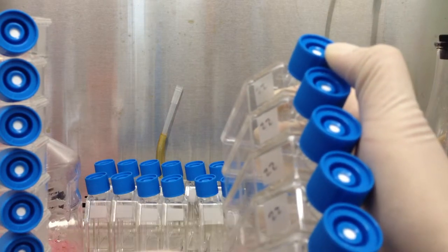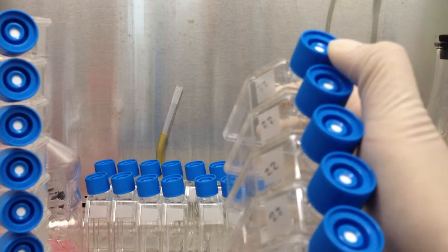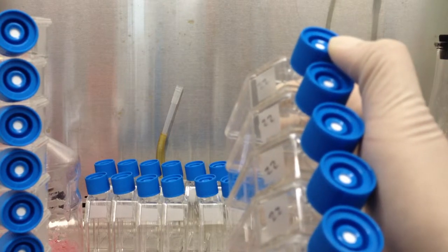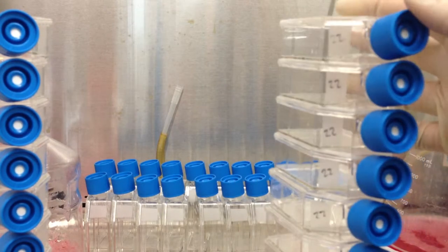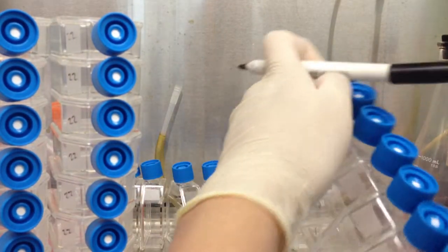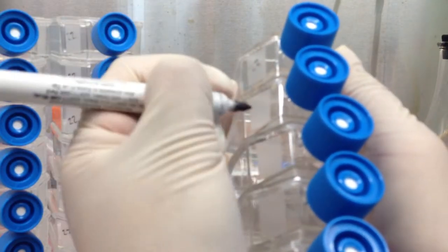And I pretty much, for organization, write the passage number on the side of the flask. And any other information that I would want to record, I write on the top of the flask. This is just to keep things organized.